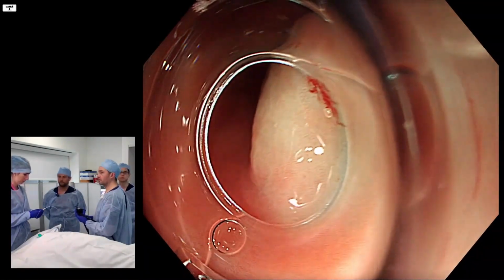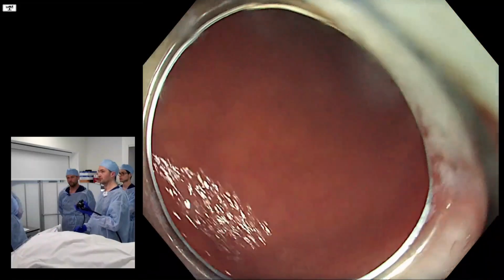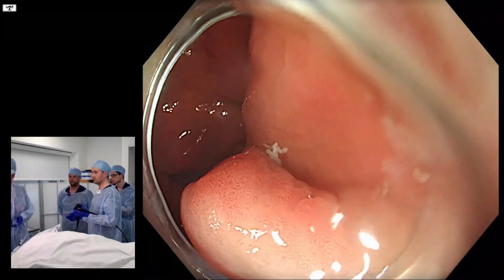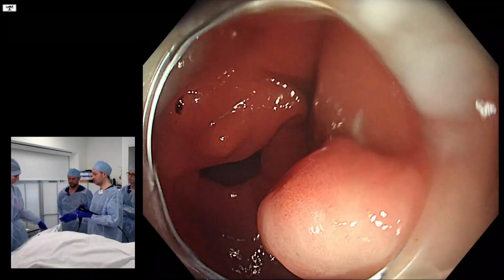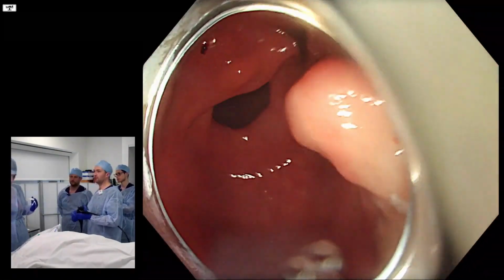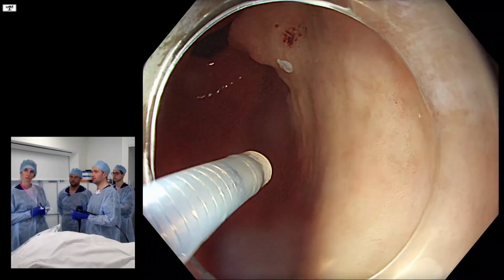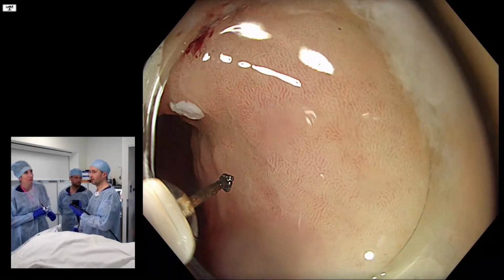Let's go endocut, thanks. So the underwater part, open, please. No, I think we can go around. Knife, please. The US was not convinced there was muscle attachment, so I think it is now proven that there isn't. What do you think? Yeah, I also think that by doing what we did, we've got a very deep submucosal plane. The only thing now is, open the thing, soft please, is to make sure we take a margin.